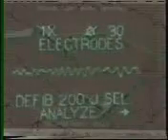Once the stat pads are placed and it has previously been established that the patient is in cardiopulmonary arrest, the ZOLL PD 2000 may now be put into action. The operator clears all persons away from the patient and then presses the red Analyze button so the ZOLL 2000 will analyze the patient's ECG. The ZOLL PD 2000 has been shown in extensive tests to be highly accurate in its analysis of ECG rhythms.